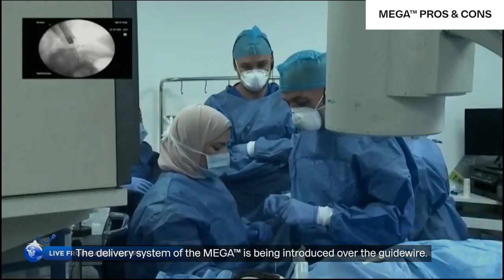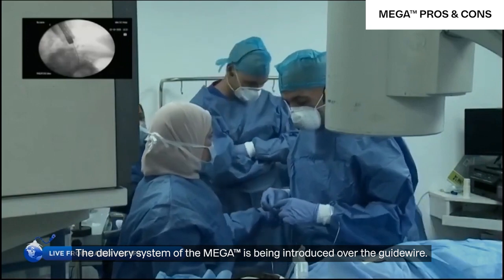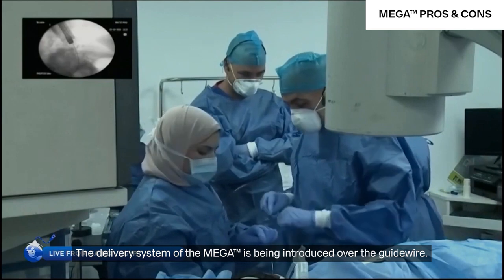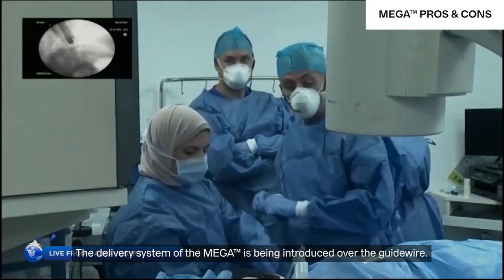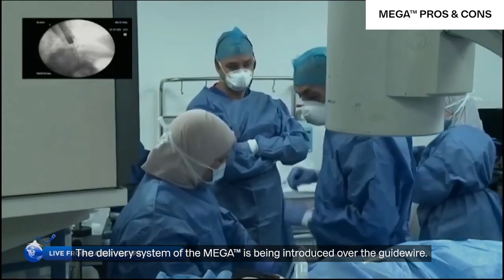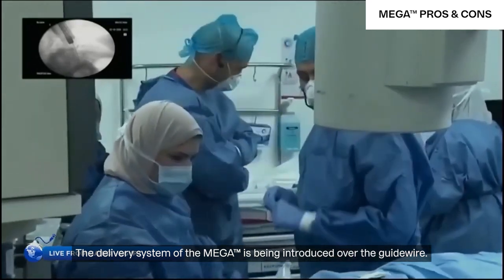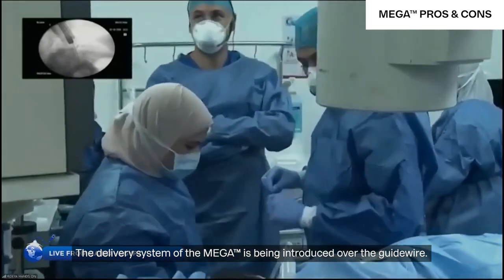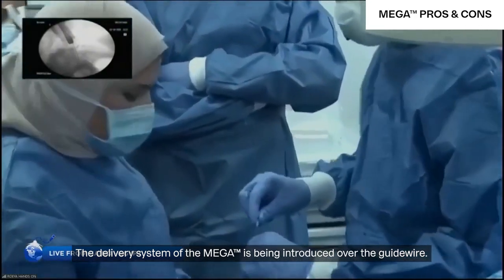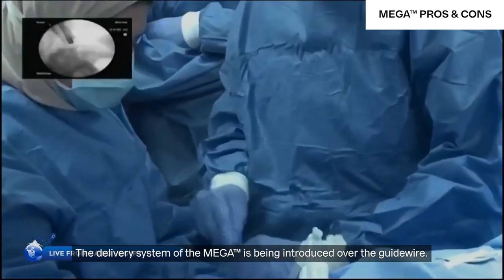The pro is that a fully covered stent is very easy to remove after 4 weeks. The disadvantage, number one, is migration. We see a lot of migration with fully covered stents. There are many techniques to address it. One of them is clipping. Nowadays there is the new stent fixation tool. Sometimes you use the Apollo to take two sutures at the proximal part, or if the stent has migrated, you can come back after a few days and just pull it back.